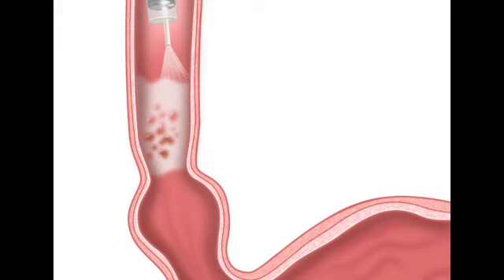Oh, it's mind-blowing. It details how doctors are finding these invisible dangerous cells without using a billion-dollar laser or some sci-fi AI tech. They're using acetic acid. Which is literally just the chemical name for something sitting in your kitchen pantry right now. Right. Vinegar. It's just wild to me. The exact same stuff you whisk into a salad dressing or use to pickle cucumbers.